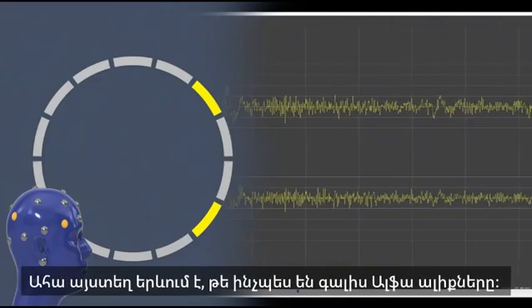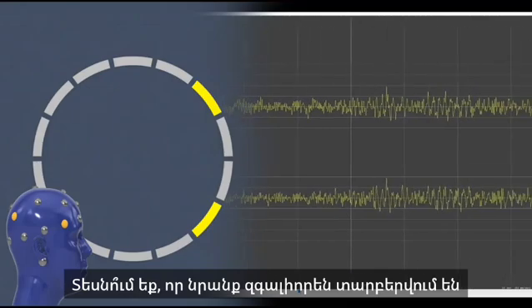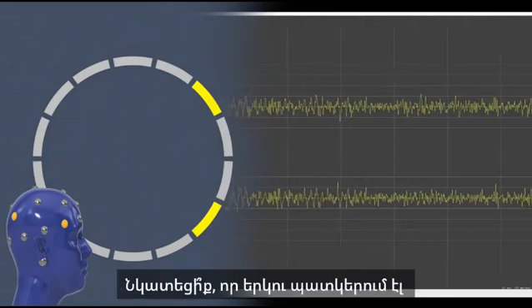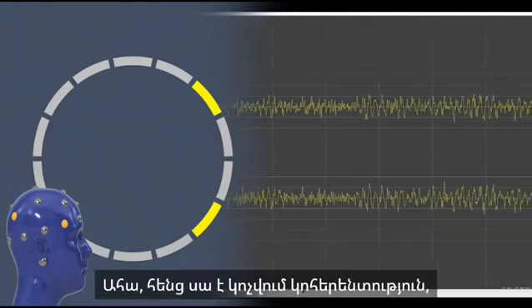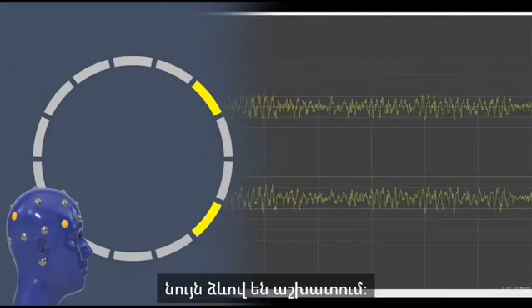Here we see the alpha waves coming now. Can you see that they look distinctly different from the smaller fluctuations? Do you notice that they come at the same time in both graphs? This is called coherence. The different areas of the brain are doing the same thing.